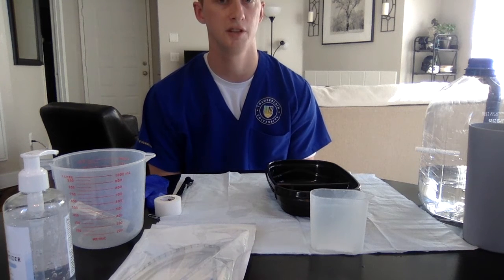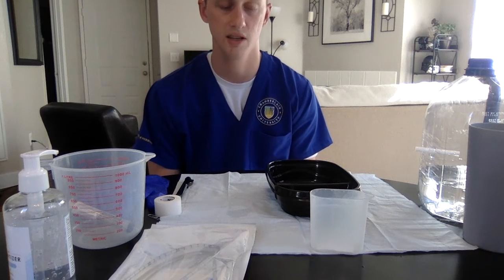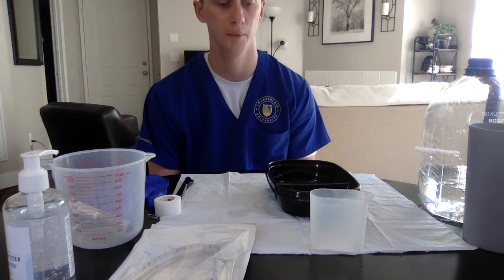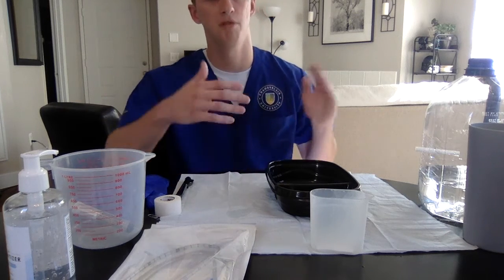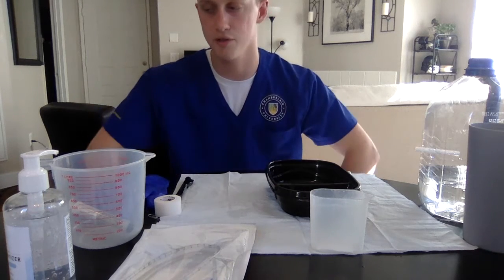So I'd say that the doctor's asked for us to put a tube down to their stomach. Do they have any questions for us, and if they consent to this procedure? So we're going to say that they say yes to all of the above. So now we're going to provide our patient privacy within our room here. We have all of our objects on a clean surface in front of us.